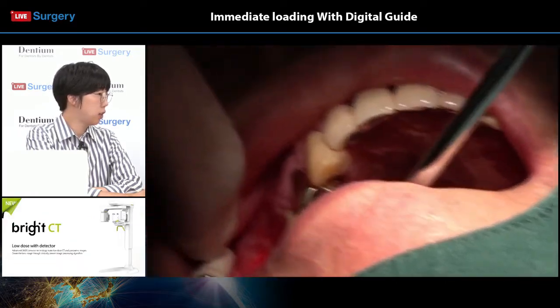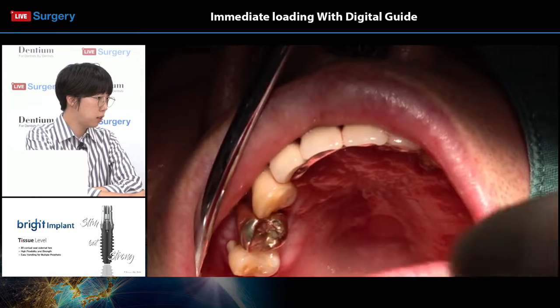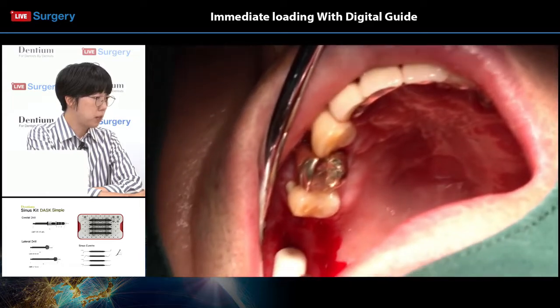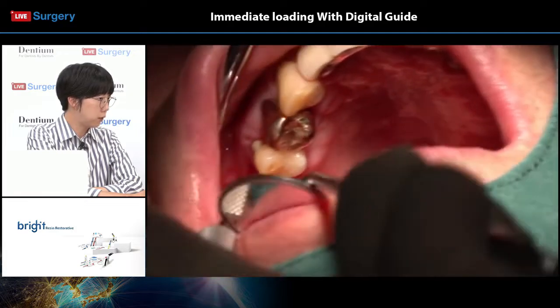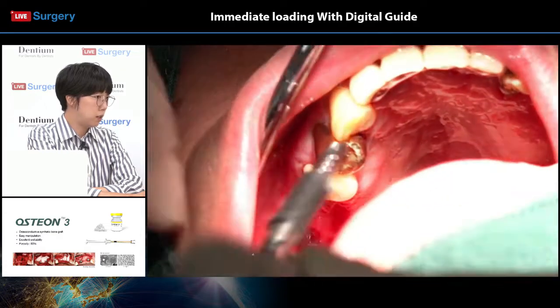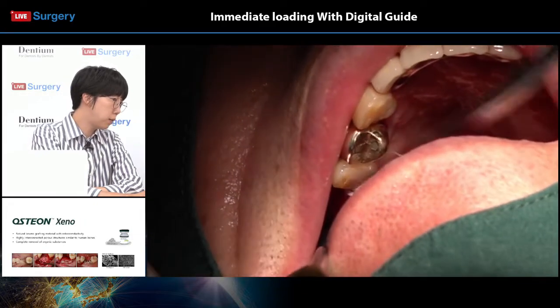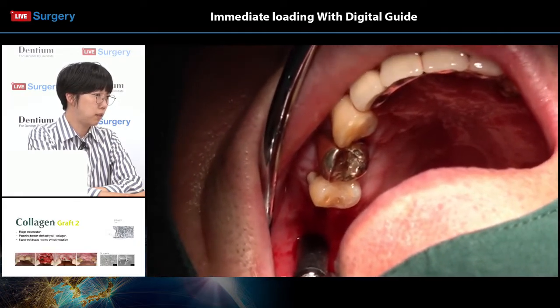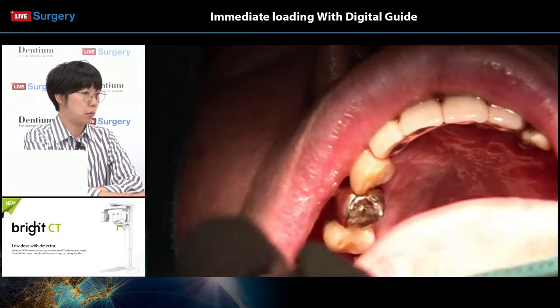When looking at the drill hole positions or the prepped areas right now, you can see that it's very close to the vestibule, and I don't think there would be enough keratinized tissue on the buccal side after the implant is placed. I think maybe the prepared place is a bit positioned buccally compared to the originally planned guide position. So Dr. Lee might have to change the position manually.